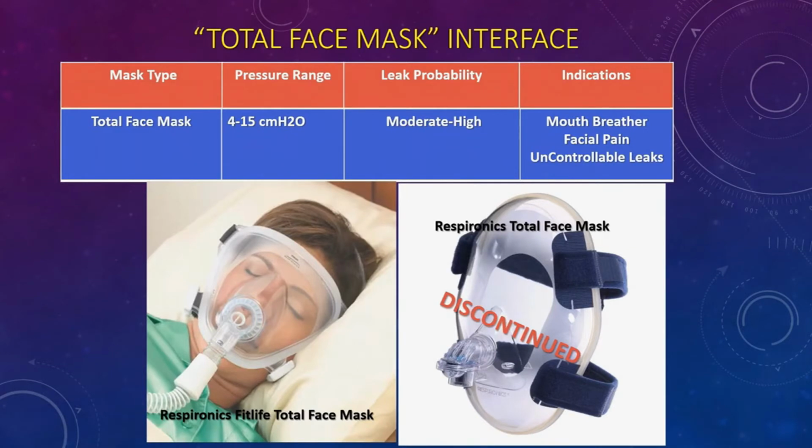The idea behind the total face mask is to avoid all of the irregular surface that the normal masks encounter, and it encircles the outside of the face where you would see more regular surfaces. The mask is pretty popular, particularly lately that it has been used very much with pediatric patients in that the mask does not rest upon the cheekbones, which with pressure can be deformed.